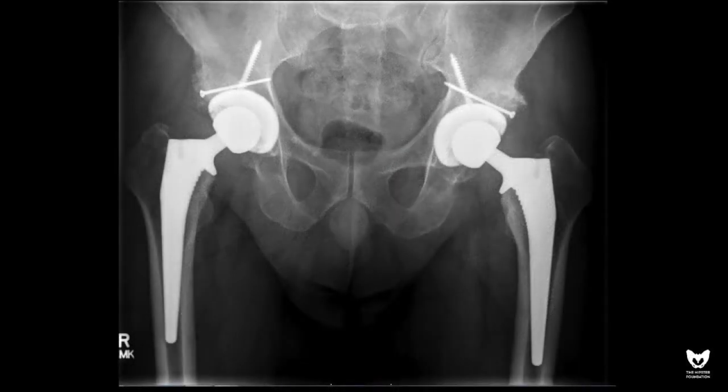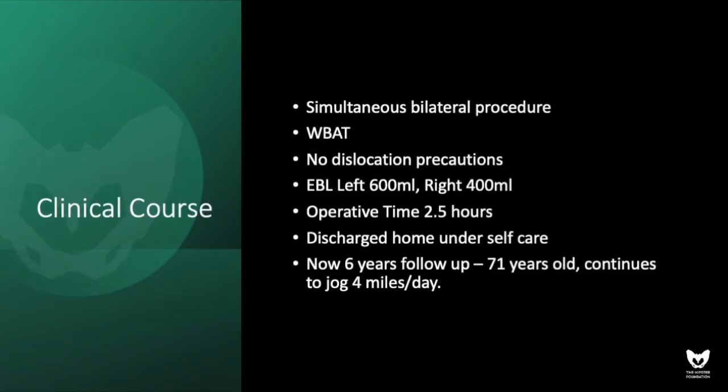In our hands, this has been an efficient way of providing structural support to an acetabular component. The benefits include almost uniform incorporation of the graft, a simplified procedure requiring only tools found in most ORs, and immediate weight-bearing. In this particular case, we applied the procedure bilaterally, allowing the patient to fully mobilize immediately after surgery without dislocation precautions.